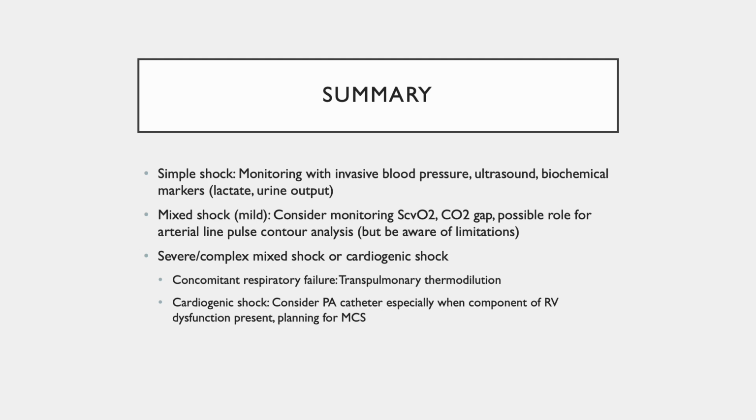Finally, it is important to remember that while these devices are useful and provide additional data points in monitoring and management of patients, they must always be considered and interpreted in the context of the patient's overall clinical situation, as well as other clinical and biochemical parameters that are available.